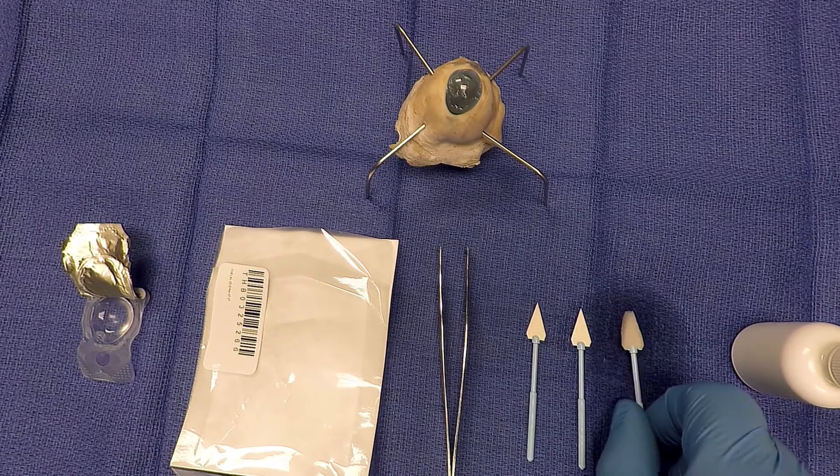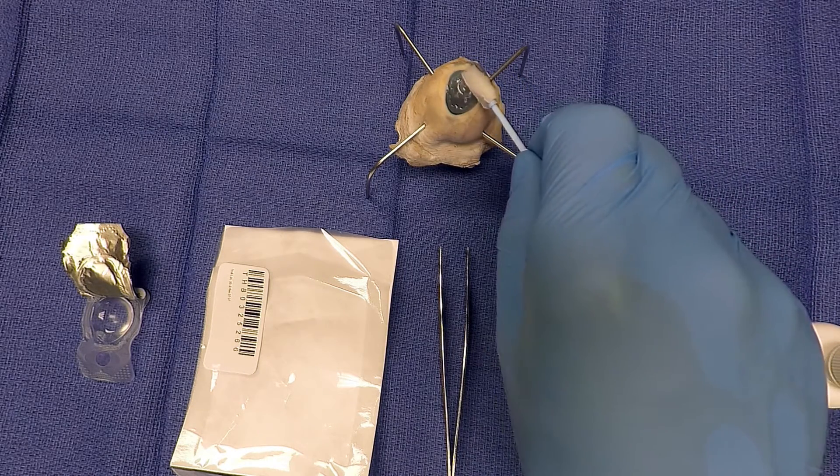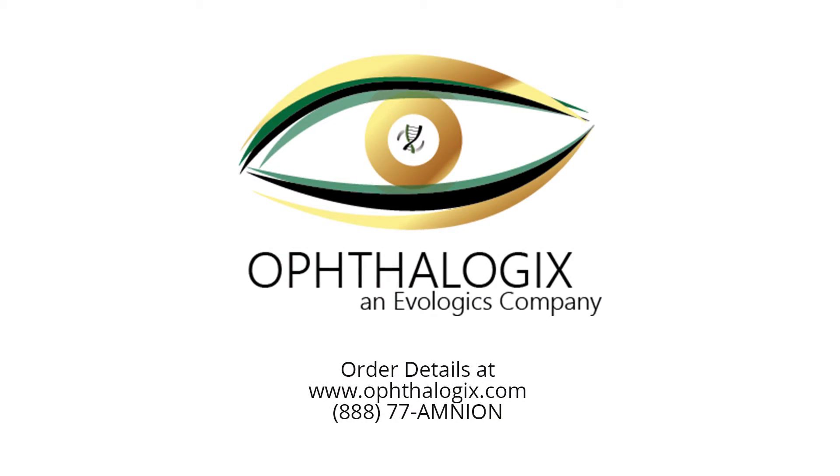The surgeon can then place an antibiotic drop over the eye if preferred. Using this antibiotic drop will not affect the properties or healing process of the amniotic membrane. Thank you.